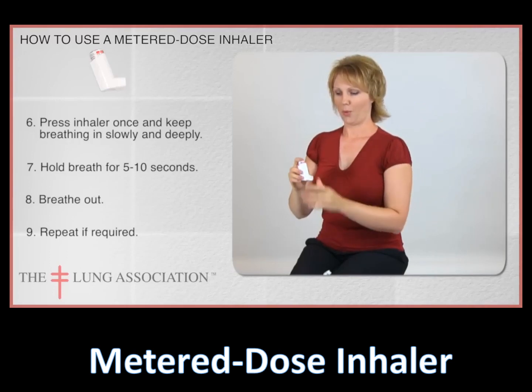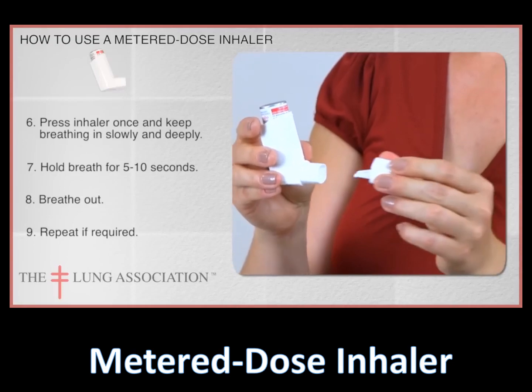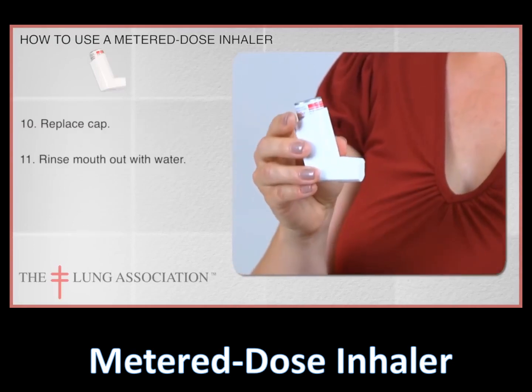Breathe out. If another puff is required, wait at least 30 to 60 seconds and repeat all these steps. Replace the cap and then rinse your mouth with water.